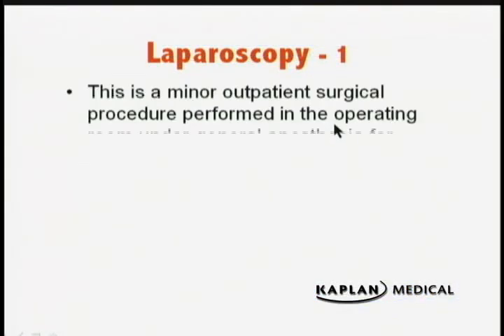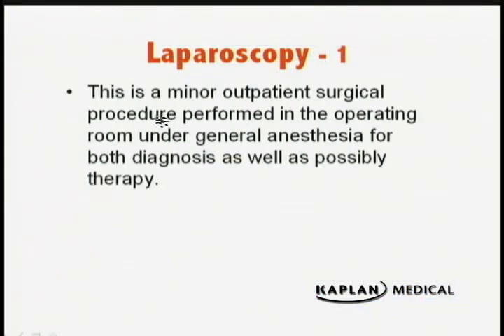Laparoscopy, oscopy, is looking into the abdominal pelvic cavity. This is a minor outpatient surgical procedure performed in the operating room under general anesthesia. And the reason you use general anesthesia is because you want to get good relaxation of the abdominal wall. You can use this for diagnosis, and we'll talk about that in just a minute, as well as therapy if you're going to be resecting or removing organs.